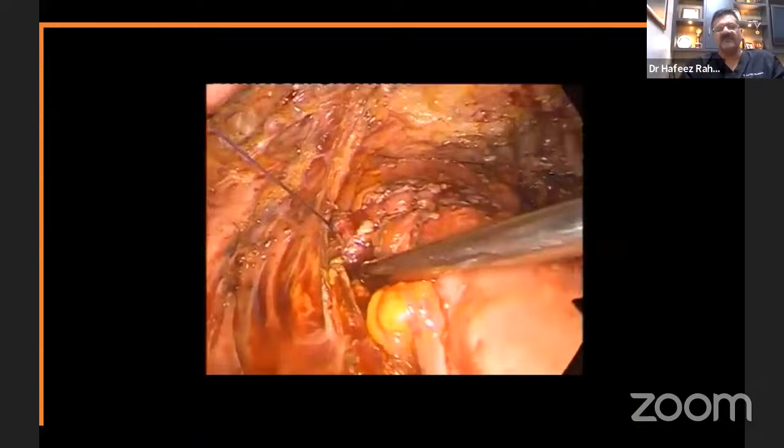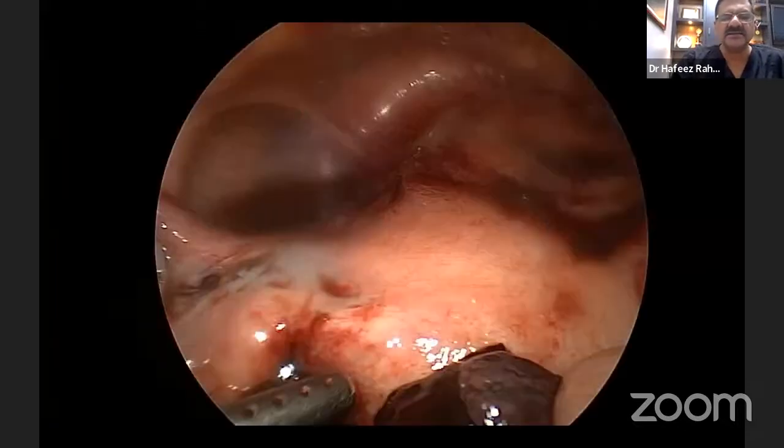lines is much better. When you suture the bowel, one of the most important things you should understand is that you have to take the exact distance between the two sutures on both sides. If you have a distance disparity between both sides, like one side you are taking 1 centimeter, the other side half a centimeter, those are the reasons for leaking. This is a very important factor to watch in this kind of suturing. And bowel is always sutured with a double layer and a peritoneal patch in those cases.